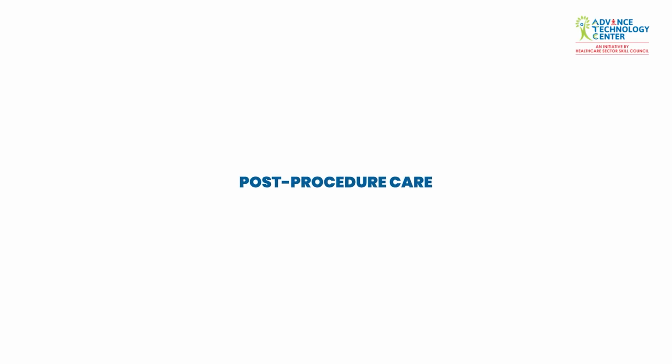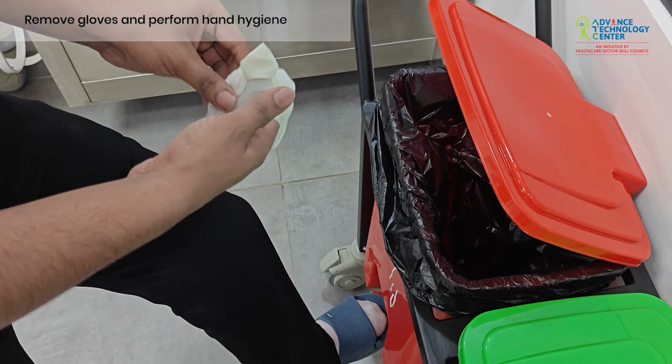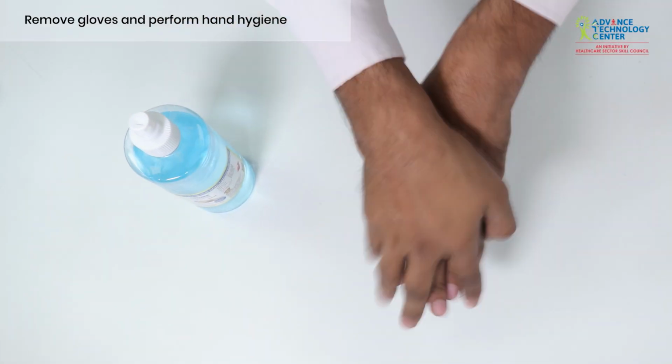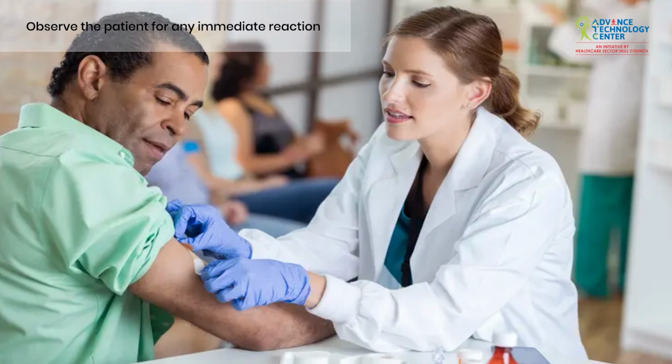Post-procedure care. Dispose of all sharps and biomedical waste in the correct containers according to protocol. Remove your gloves safely and perform hand hygiene to prevent infection. Document the medication given, the dosage, the time, and the injection site in the patient's chart. Observe the patient for any immediate reaction, such as pain, swelling, dizziness, or signs of allergy.